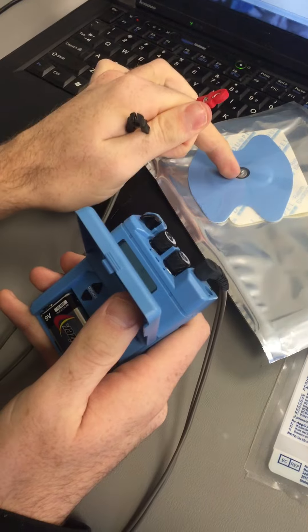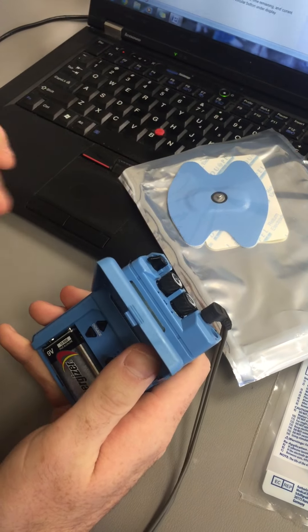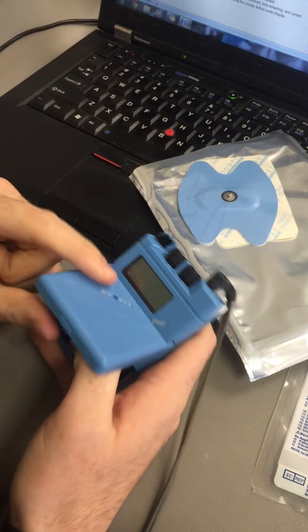You set her up — put the medication pad on her medial heel, put the dispersing pad distal to that, and make sure everything is attached properly.